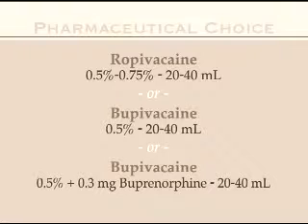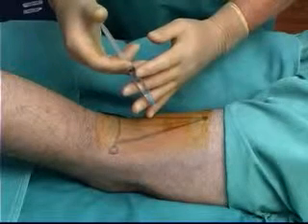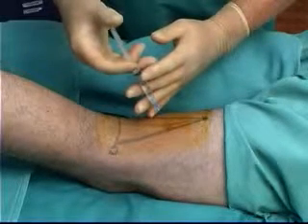It should be obvious that if long-lasting local anesthetic agents are used, the possible complications of this block will also be long-lasting. It is, therefore, advisable to rather place a catheter for continuous nerve block should a long-lasting block be required. The patient is placed in the prone position with the knee slightly flexed.